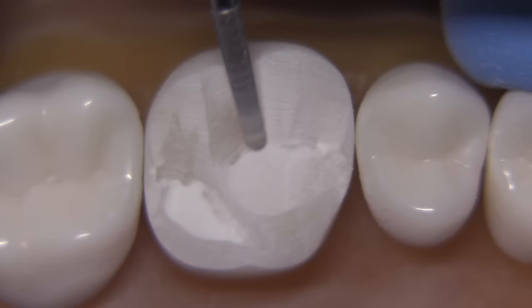When you're finished prepping this tooth, even a novice dental student would still be able to cite all of the morphological features and identify this as a maxillary first molar. At this point we've completed the basic occlusal reduction. You can see that the morphology is still there. I'm going to use a little pink marker to mark the cusp tips on the adjacent teeth and then mark the lingual cusp tips to see that they all line up in a nice arc form — and they do. This does not apply to the facial cusp; it's only for the lingual cusp.